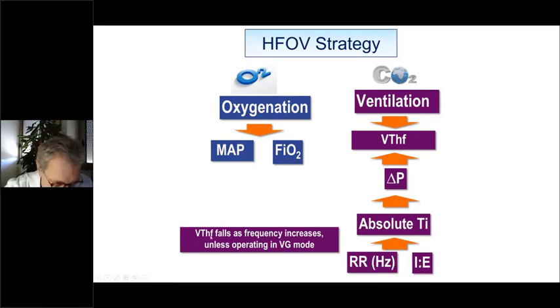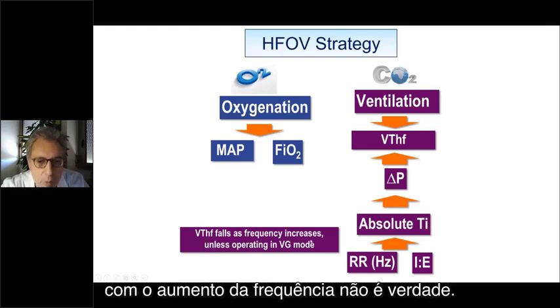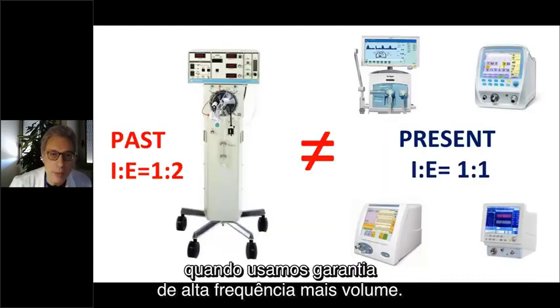to deliver the same tidal volume. So the sentence that tidal volume falls as frequency increases is not true when we use high frequency plus volume guarantee.